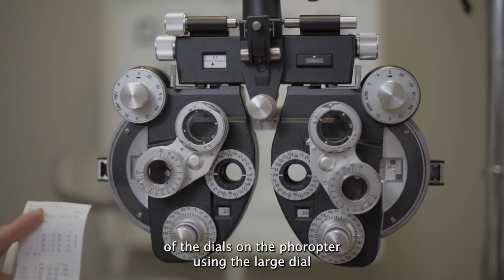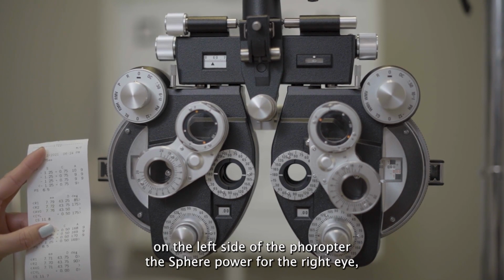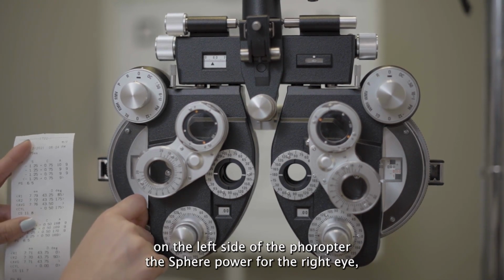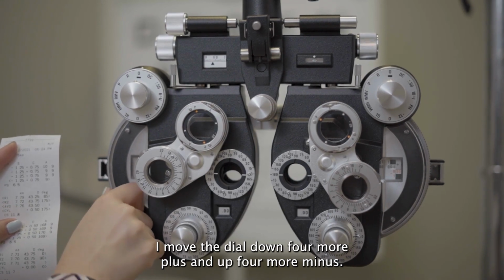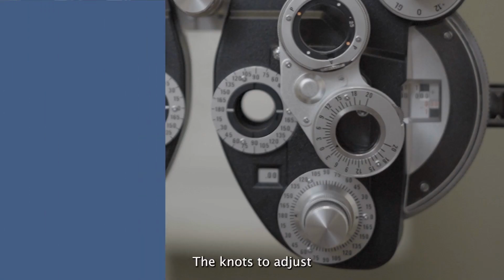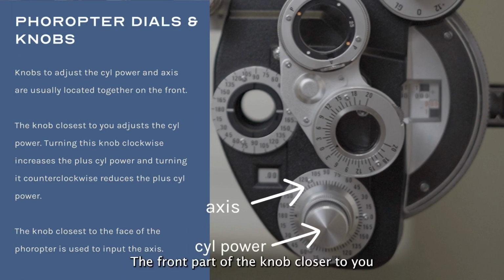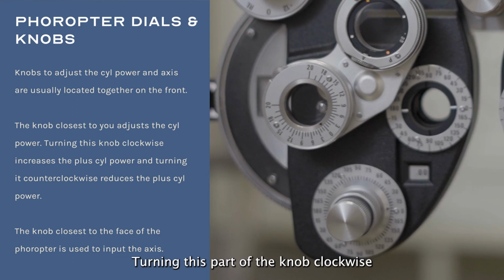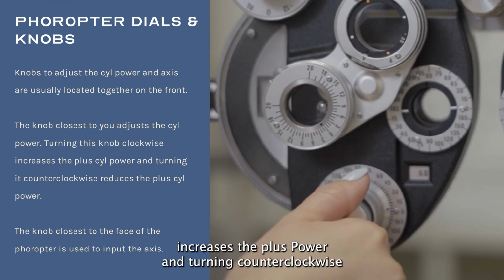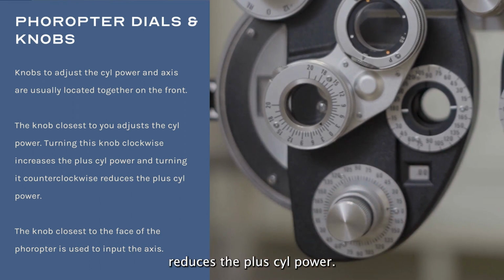Now let's look at some of the dials on the phoropter. Using the large dial on the left side of the phoropter, input the sphere power for the right eye. Move the dial down for more plus and up for more minus. The knobs to adjust cyl power and axis are usually located together. The front part of the knob closer to you adjusts the cyl power. You can feel the knob click into position. Turning this part of the knob clockwise increases the plus cyl power, and turning counterclockwise reduces the plus cyl power.